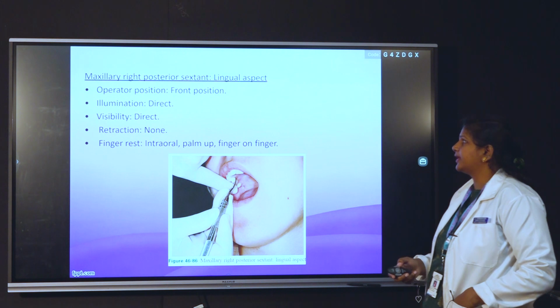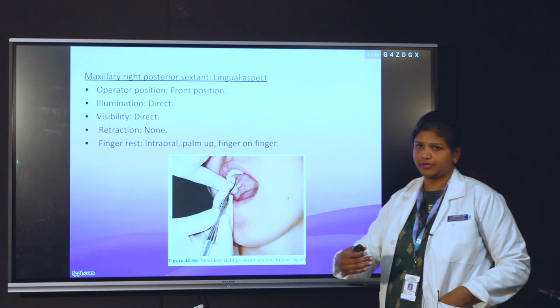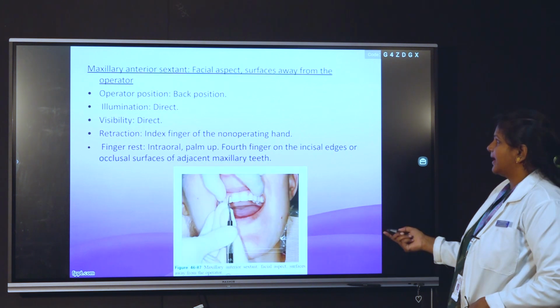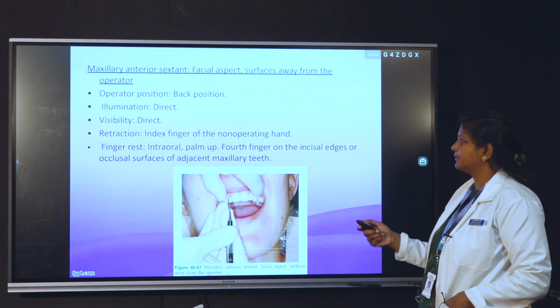Coming to the maxillary right posterior sextant, lingual aspect, the operator position should be in front of the patient. Illumination is direct, and the finger rests are intraoral, palm up, or finger on finger. Maxillary anterior sextant, facial aspect, surfaces away from the operator.